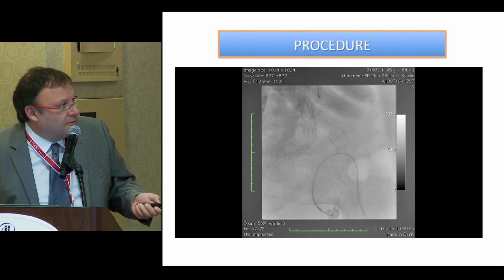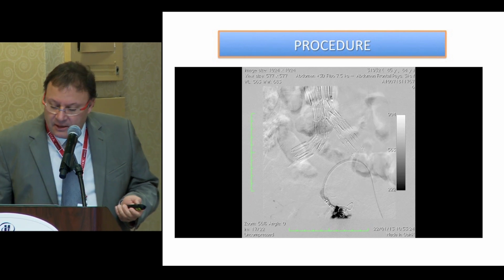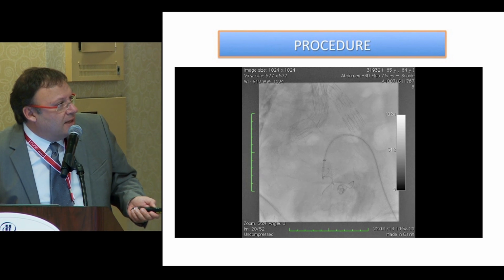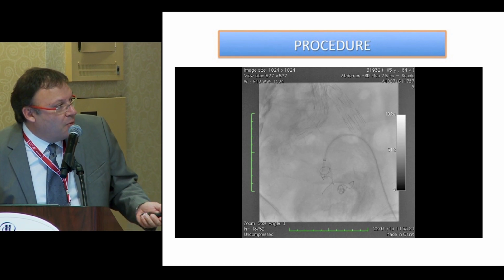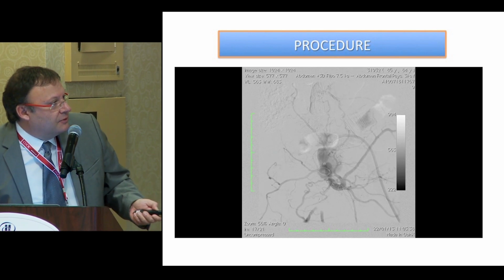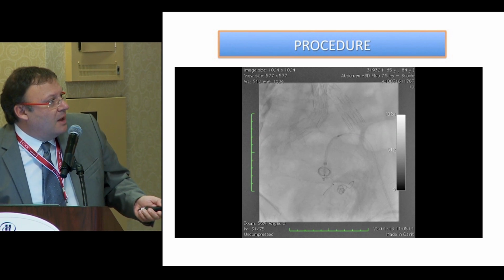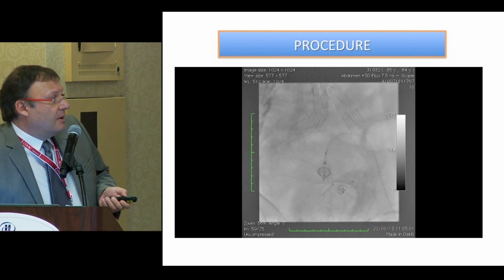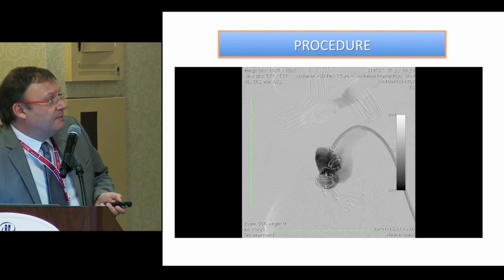But what was interesting, we had a short neck here, and we decided to treat it only with embolization, and we cannulated first from the ipsilateral groin, and went very distally, and were able to deliver through the leader some coils. We added a short Amplatzer plug.